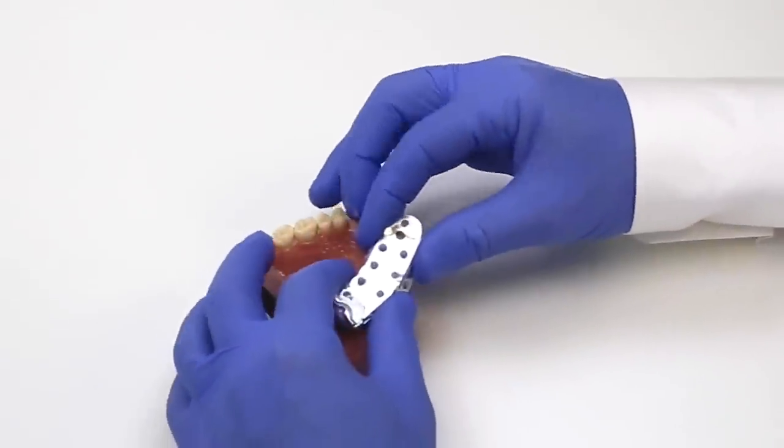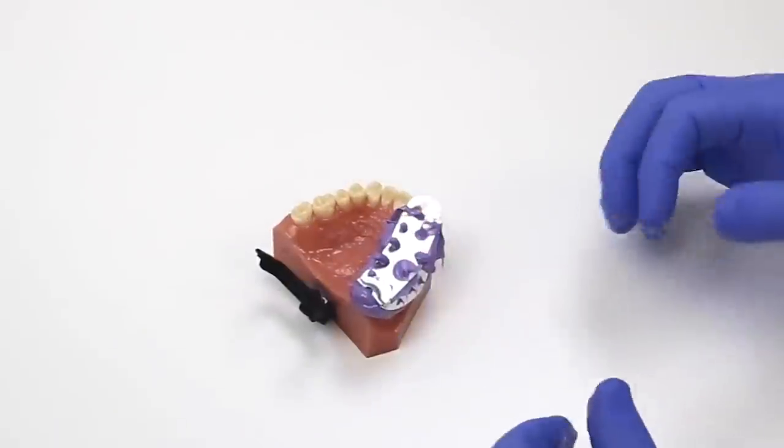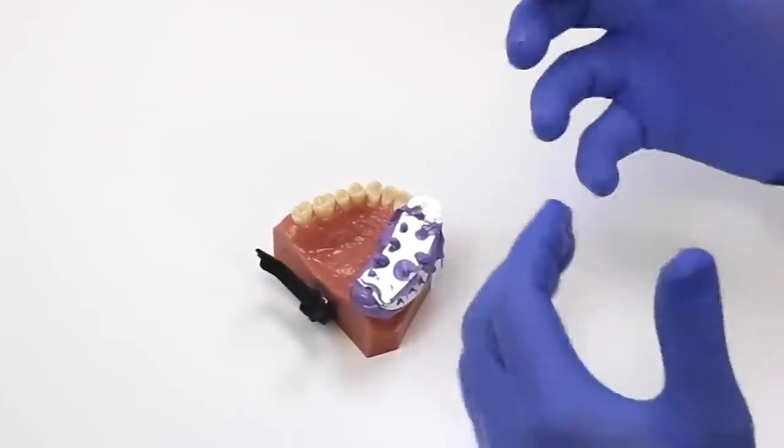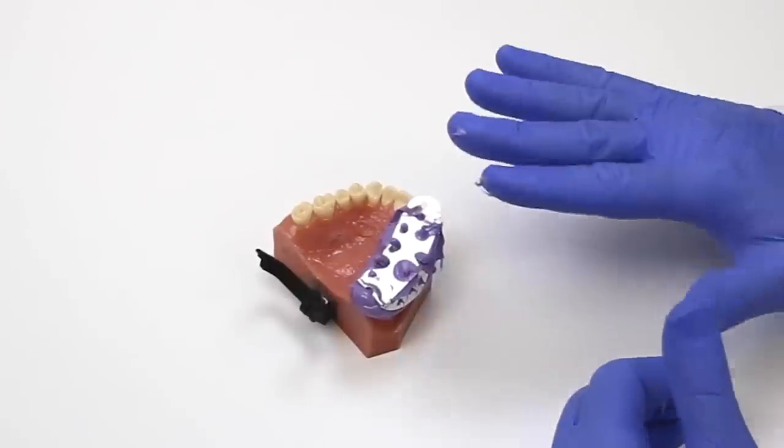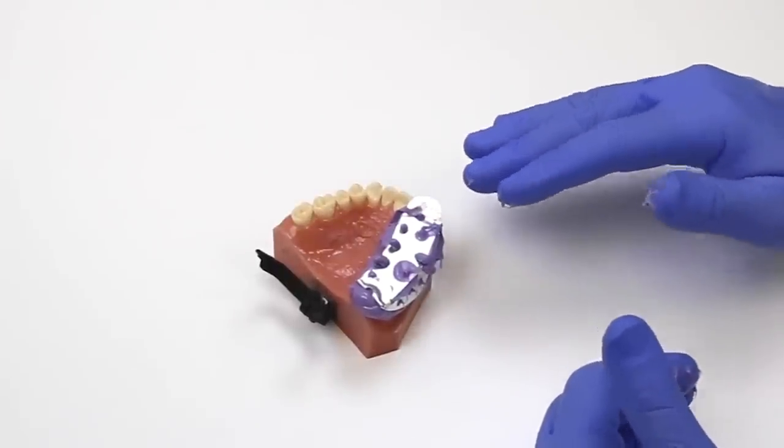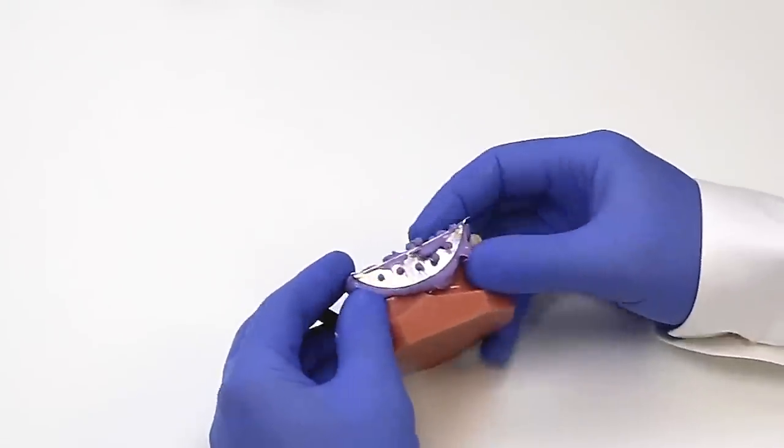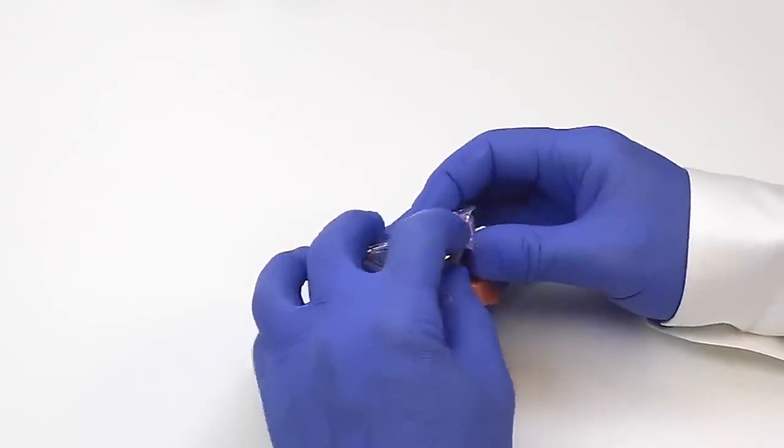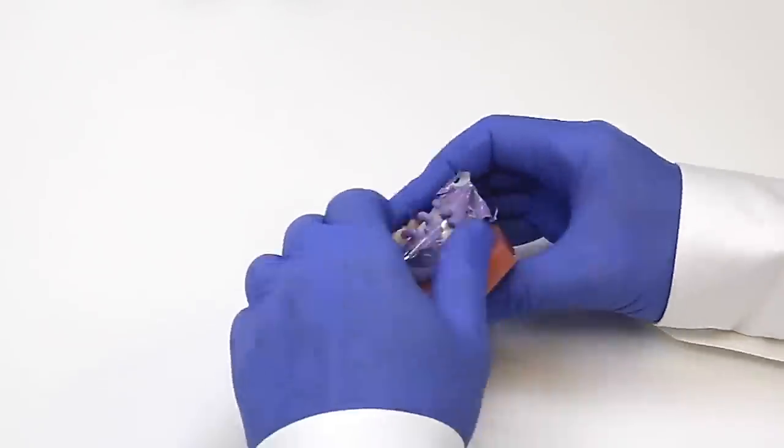And we're just going to place it over the unprepared tooth. And because of the perforations in the temp tray, this is going to lock the material in. It's only going to take 30 seconds intraorally. After 30 seconds, you're going to check it, it's nice and hard. We're going to roll it off.